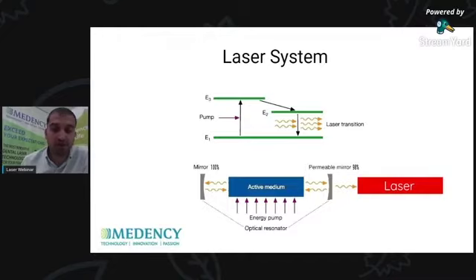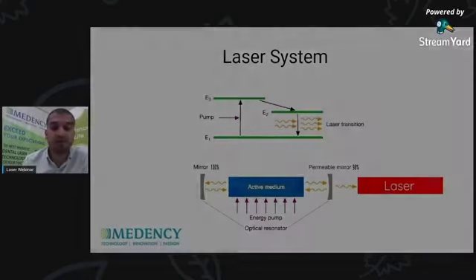After a certain amount of energy, the laser beam starts to go through the mirrors we have in the laser component. I'm trying to simplify this component. It's much more complicated than that, but I'm trying to explain it in a simple way.